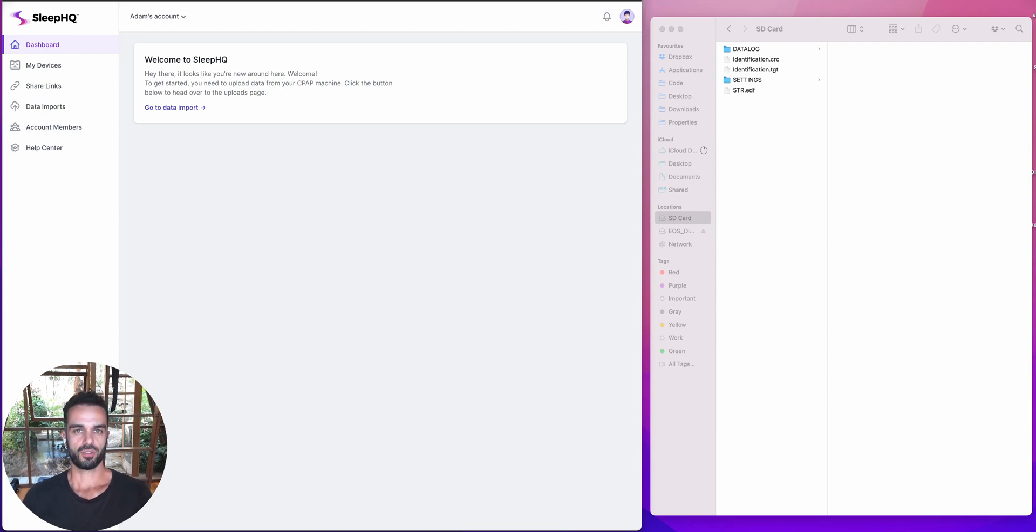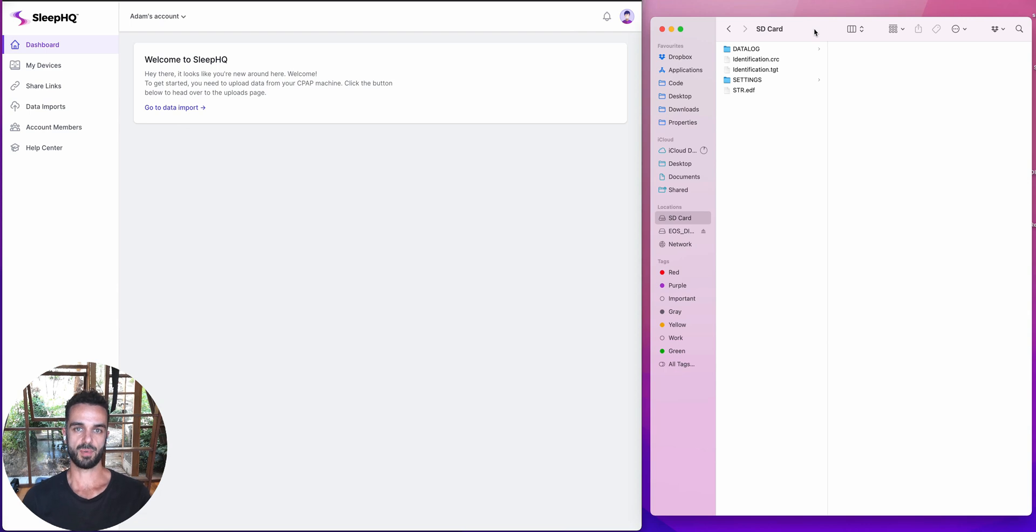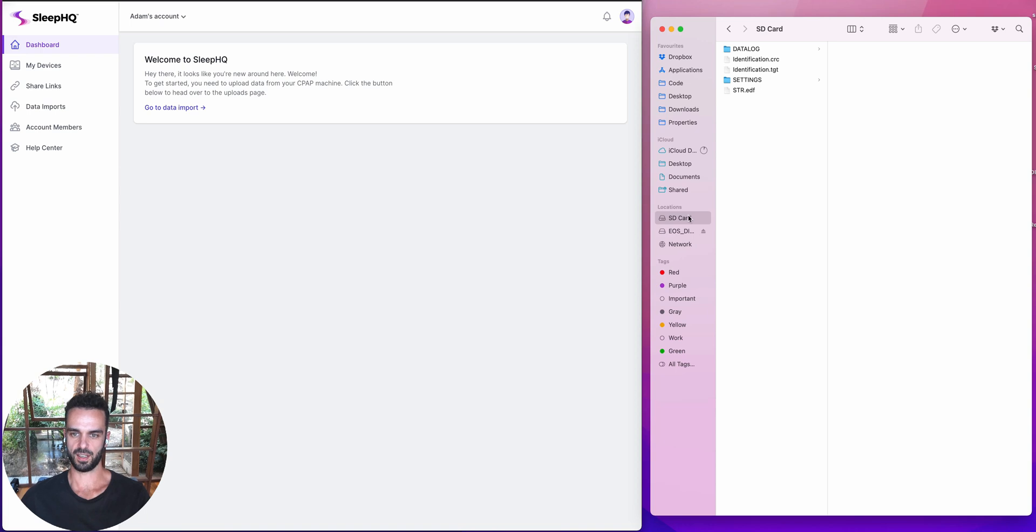To start off with, I've created a new account on Sleep HQ and I'm logged in in my browser over here. And then over on the other side, I've got my SD card. So I've taken the SD card out of my CPAP machine and I've plugged it into my computer just using a regular SD card reader. So you can see down here that that's it there.